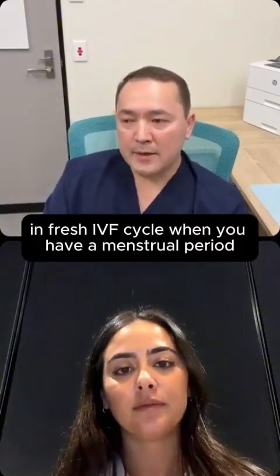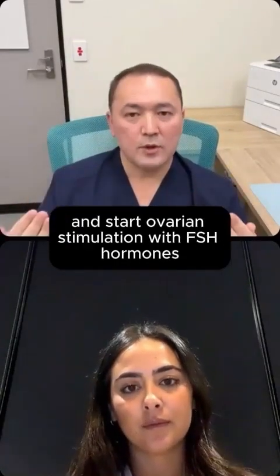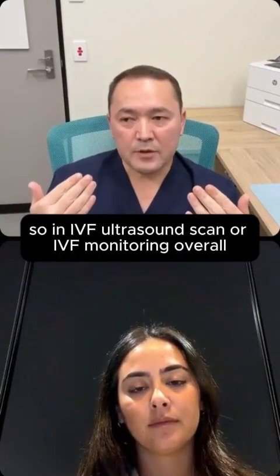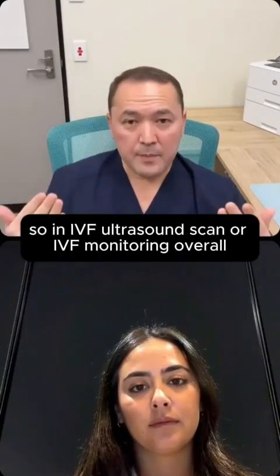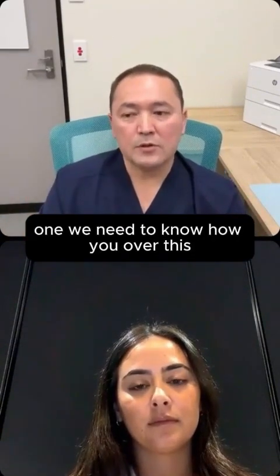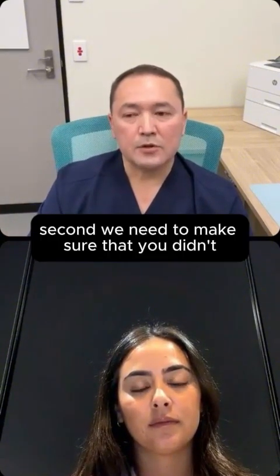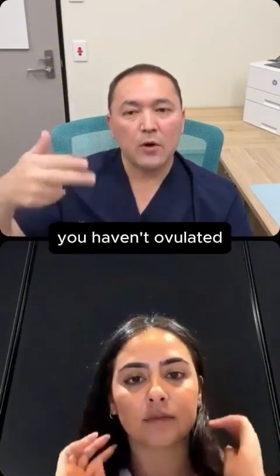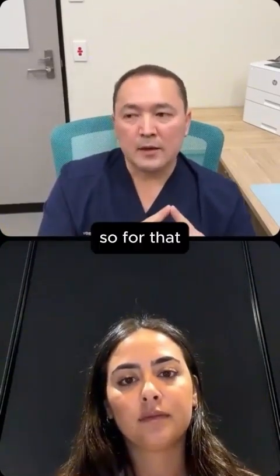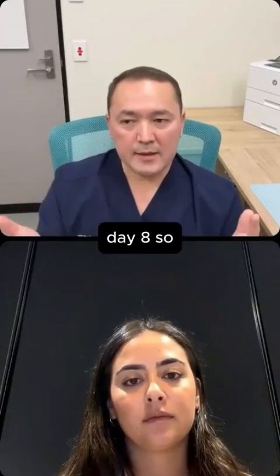In a fresh IVF cycle, when you have a menstrual period and start ovarian stimulation with the FSH hormones, in IVF monitoring overall, we need to ensure a couple of things. One, we need to know how your ovary is responding to stimulation. Second, we need to make sure that you haven't ovulated by the time you reach the egg collection. For that, the ultrasound scan generally can be started from day 7, day 8.